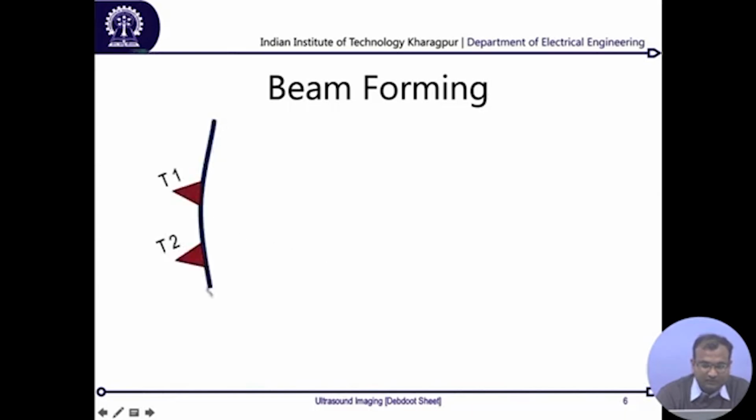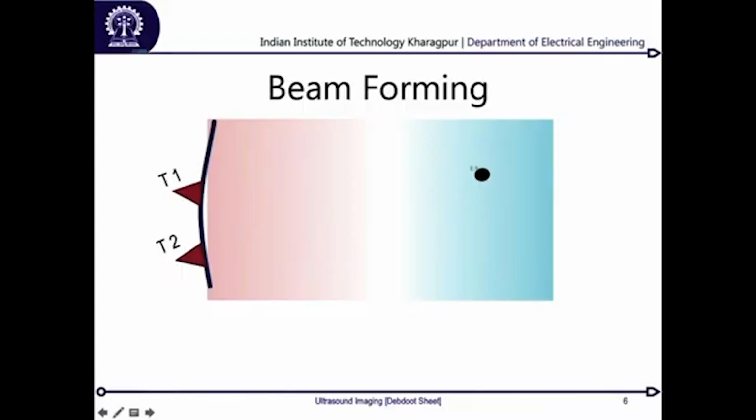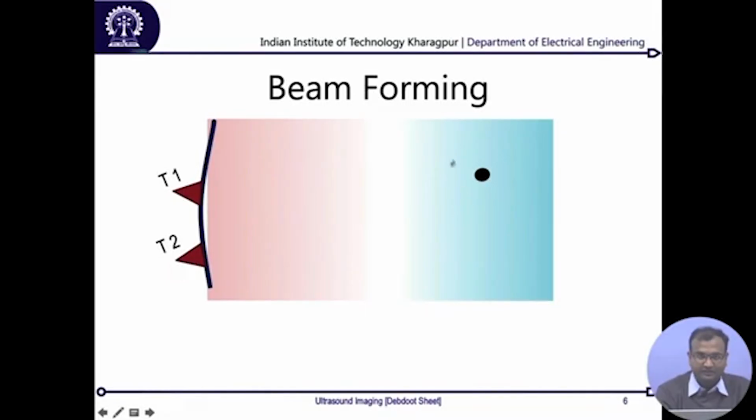So, say you have the surface and two transducers present over there, and you have your reflector over here. Now, say that you had already formed the beam during forward transmission, which means your acoustic beam was already sent. Now this point was located on your acoustic beam, and it starts sending out. So now your transducers are behaving in a receiver mode, no more in a transmitter mode.